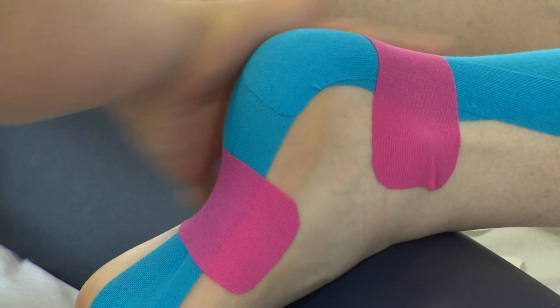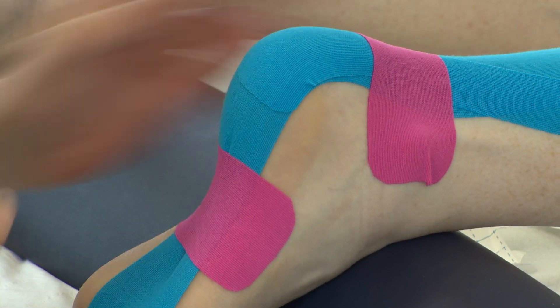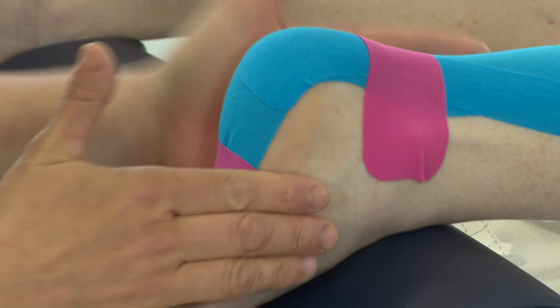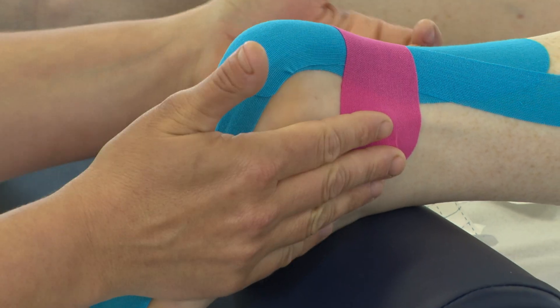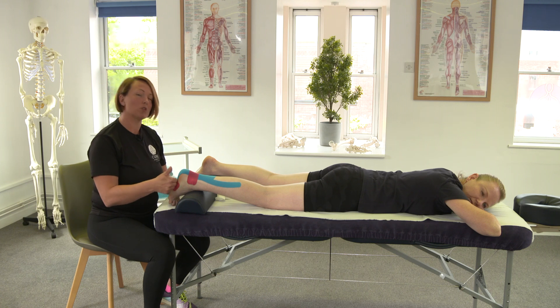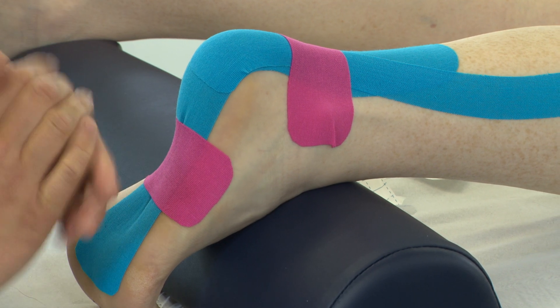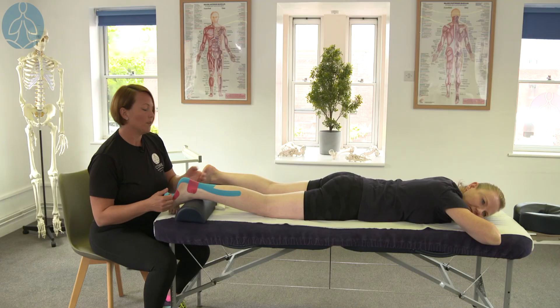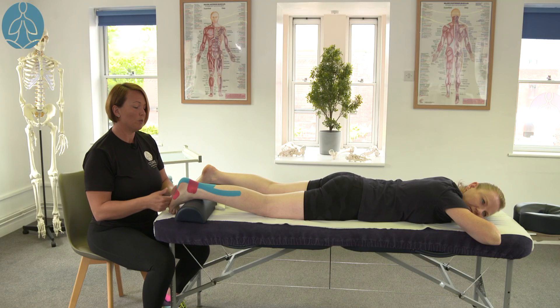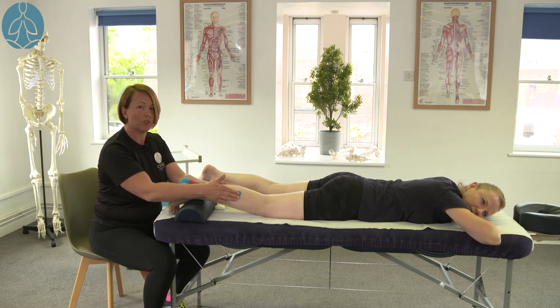Any creases that you want to pull out, you will have to take the tape off and reapply it — once the tape's been applied you can't then reapply it. So if the client has any creases on the bottom of the foot, take that tape off, cut a new piece of tape, and then reapply it. So this is a taping technique for plantar fasciitis which supports the Achilles, the soleus, and the gastroc.